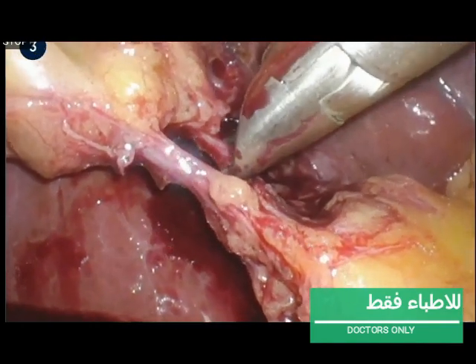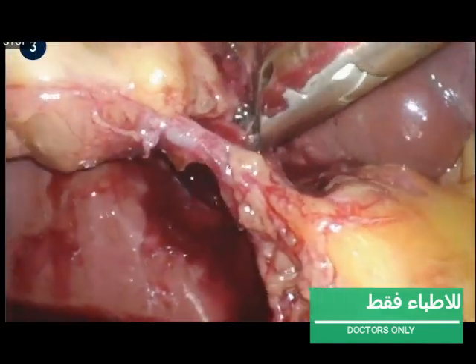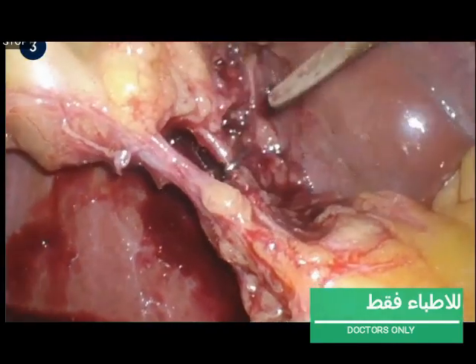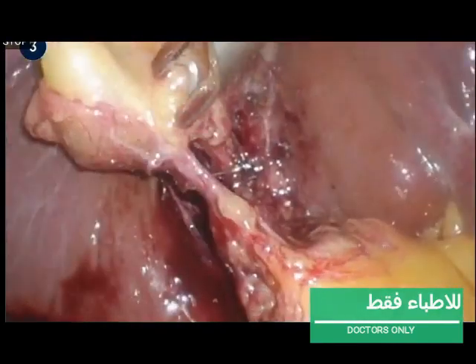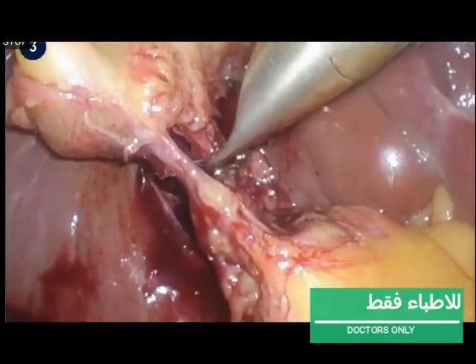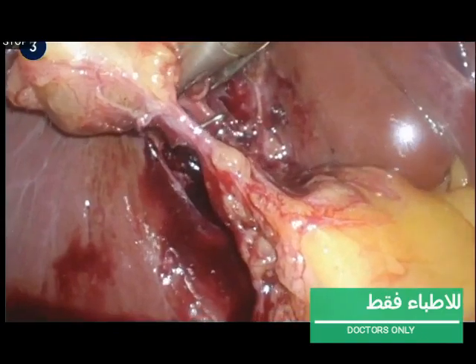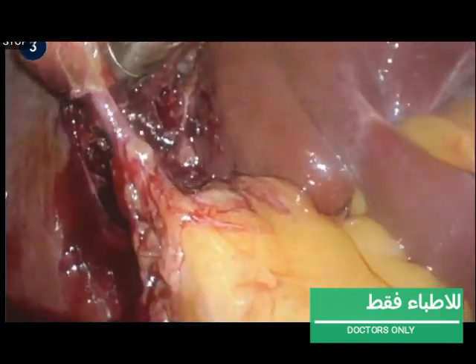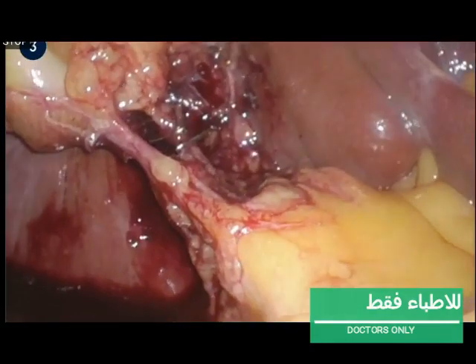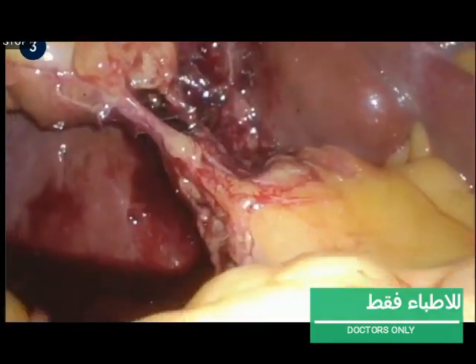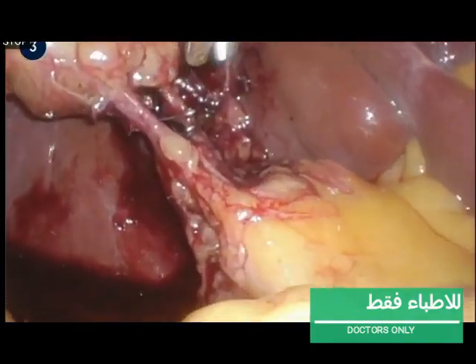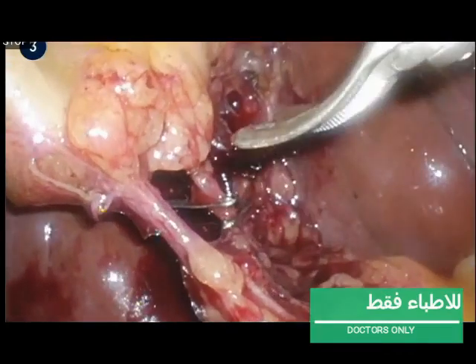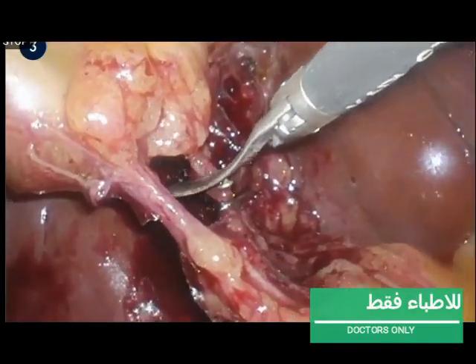The cystic artery is clipped three times and transected as near to the gallbladder as possible. Begin with the artery, as transecting the cystic duct first may tear the artery. In case of severe infection, the artery is much thicker and a suture may be placed in order to ligate it.